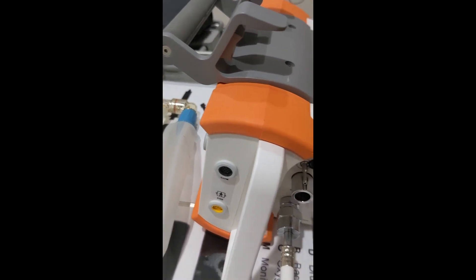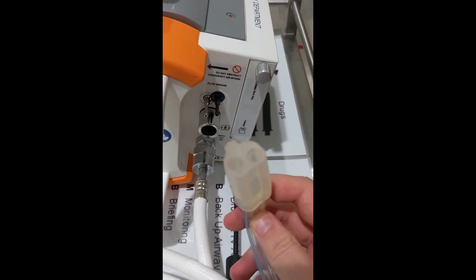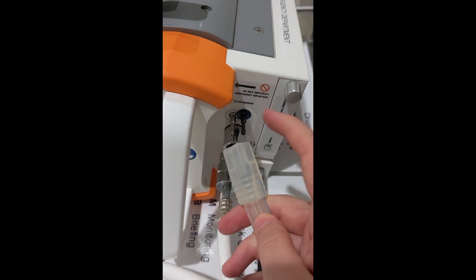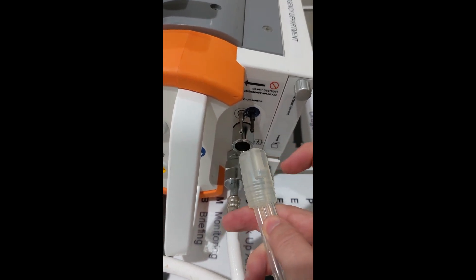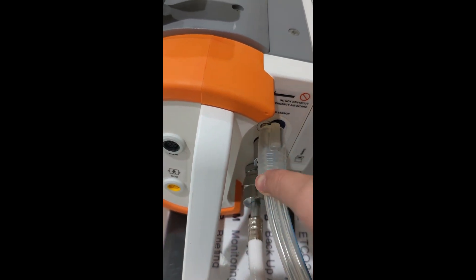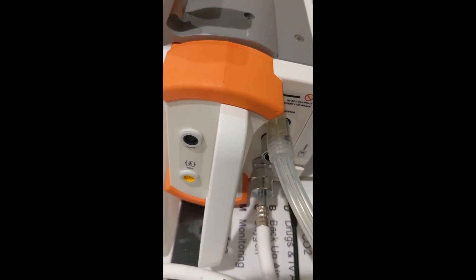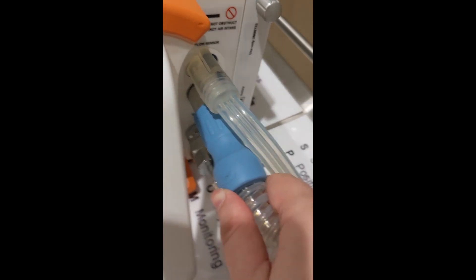Next we're going to attach the breathing circuit to the side of the ventilator. This port is the flow sensor. It only fits one way. This square section goes towards the top. It will slide on easily. Then we put the bigger blue connector onto the big silver connector and secure it.